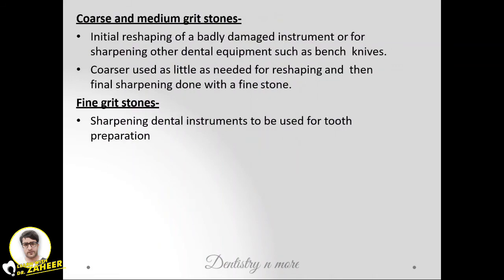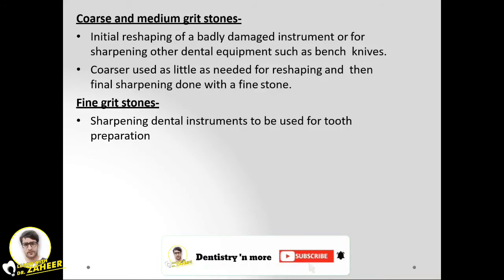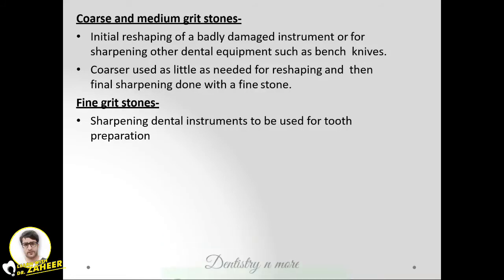So coarse and medium grit stones are used for initial reshaping of a badly damaged instrument or for sharpening other dental equipment, such as bench knives. The coarser grit is used as little as needed for reshaping, and then final sharpening is done with a fine stone. The fine grit stones are used for sharpening dental instruments to be used for tooth preparation.